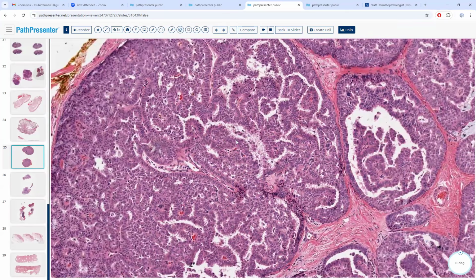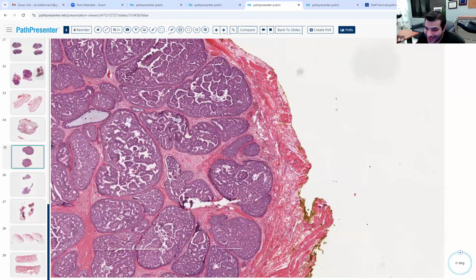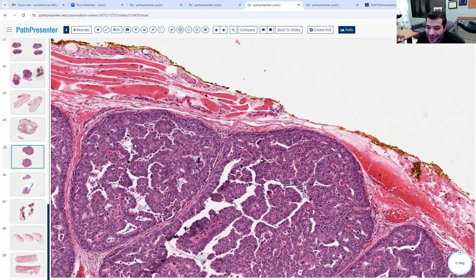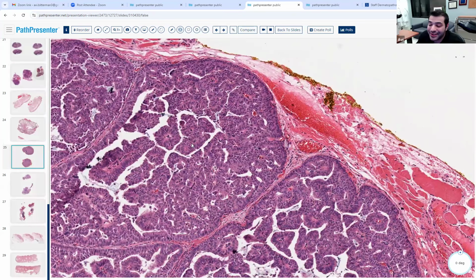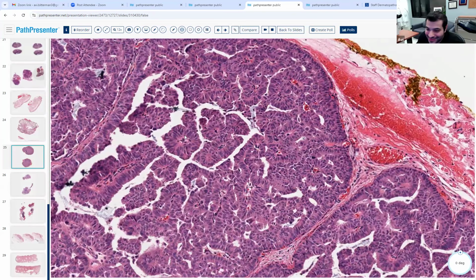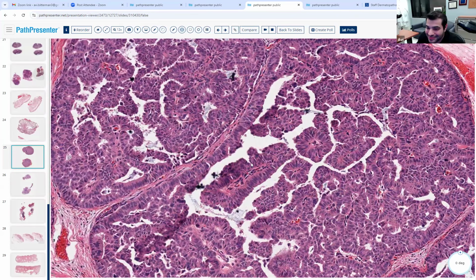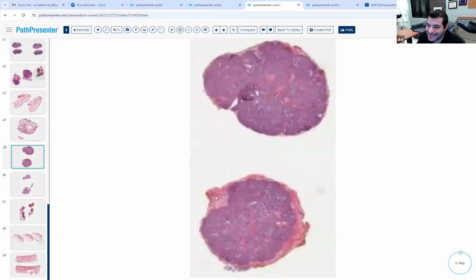Is this the nipple adenoma? That's another. Okay, so nipple adenomas can look like this, can have that papillary appearance as well. But this is, okay, location is important. If I told you this was on the eyelid, so this is also from the eyelid, as is this.